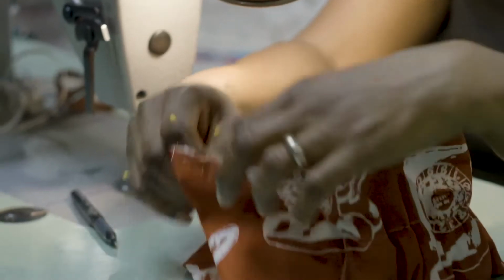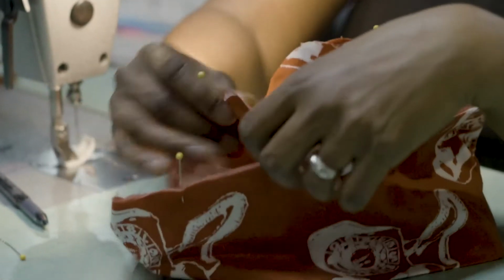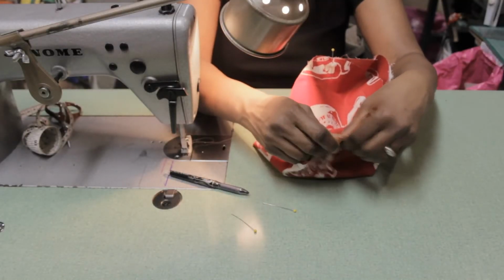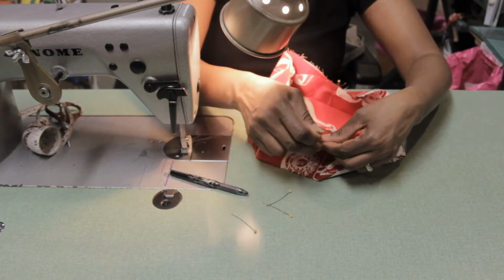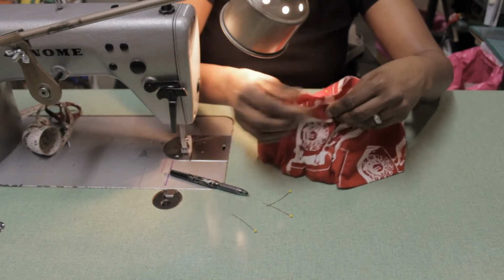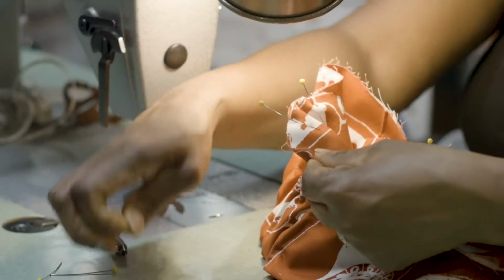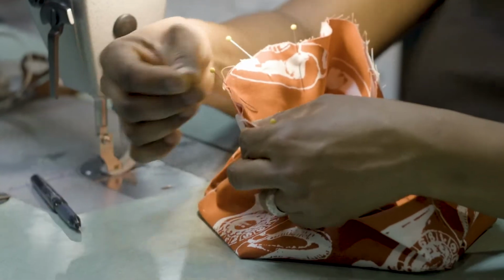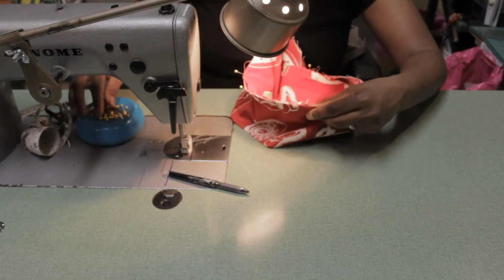Pin there, then the next 2 that are lined up, we'll pin those together. Then the 2 front ones, we're going to pin those together. And then finally our 4th one, the side one, and we will pin those together. Now all we're gonna do is we're going to make sure that all these seams are lined up. So we're kind of just pulling it a little bit and using our pins and just pinning them all together, because we're going to then sew this top to our side band.